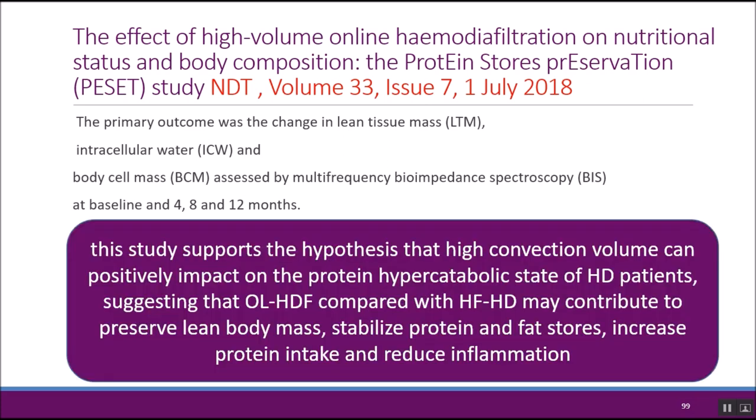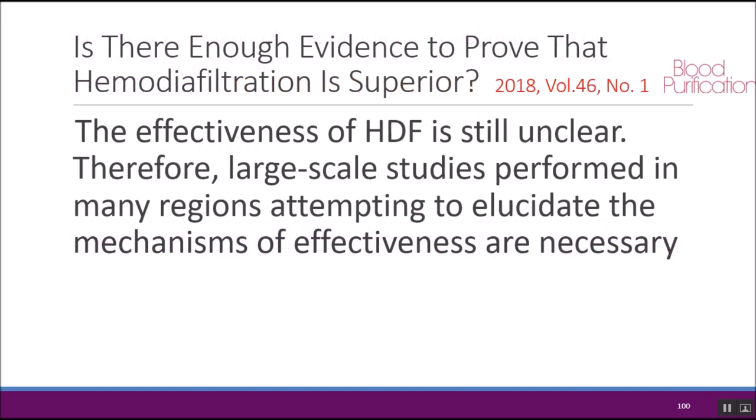Many studies support the hypothesis that high convection volume can positively impact the protein hypercatabolic state of hemodialysis patients. So online hemodiafiltration compared with high flux may contribute to preservation of lean body mass, stabilize protein and fat stores, increase protein intake, and reduce inflammation by removing cytokines during sessions. Although the effectiveness of hemodiafiltration is still unclear in much of the literature.